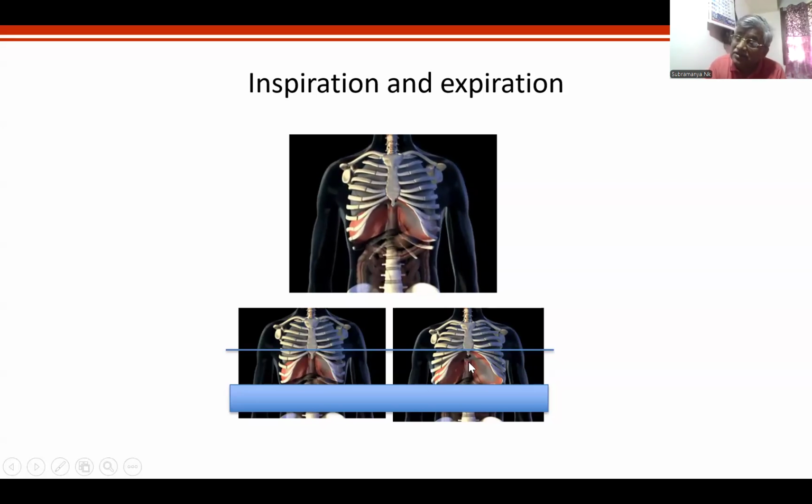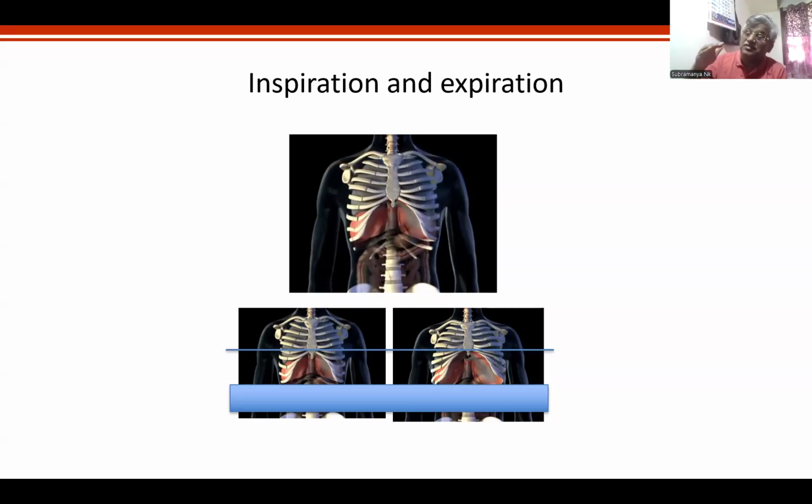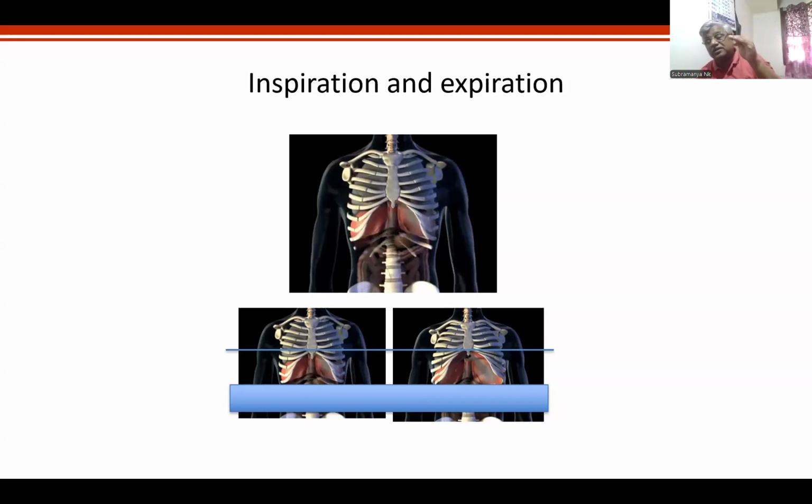Although X-ray gives you 50-50% image sharing for the upper half and lower half of the chest, the pathologies are 75% to 25% for lower half versus upper half. That means, Dr. Charul, it's not about bucket handle movement.